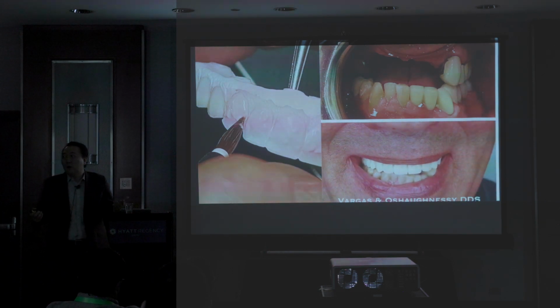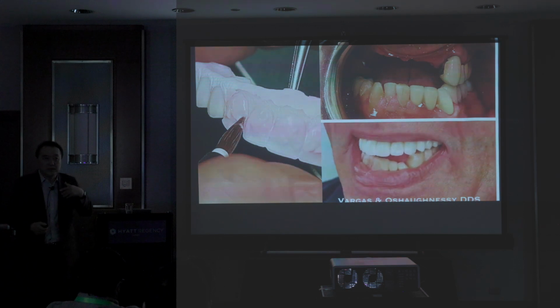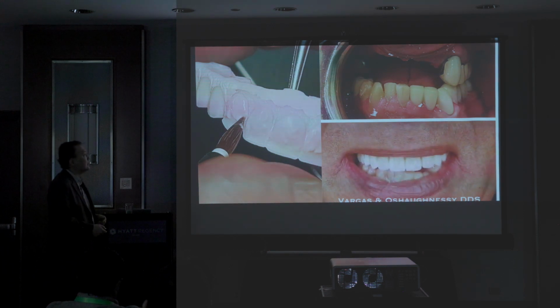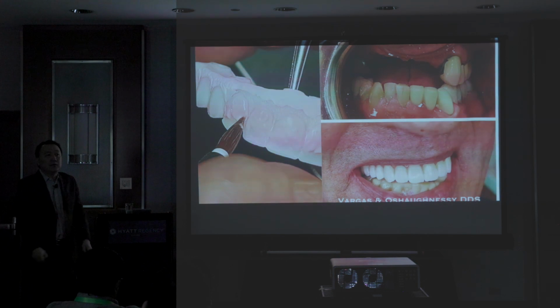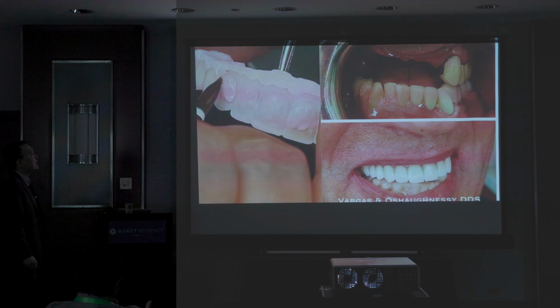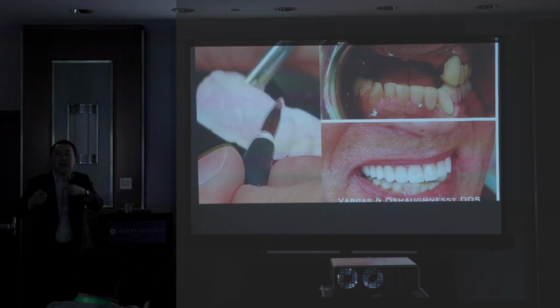Now the dilemma about the full mouth case is the coloring. I want it brighter than the lower teeth, right? I want it brighter than the lower teeth. That's after they try in the 6 implants, and then you can see it directly. So it doesn't matter where the local dentist is, they can be over 1,000 miles away, and I can get better information from them because we communicate over the internet.